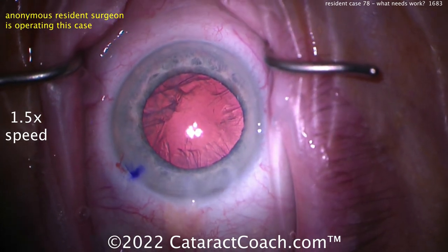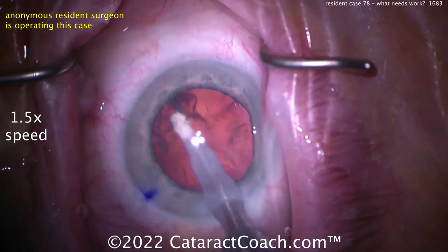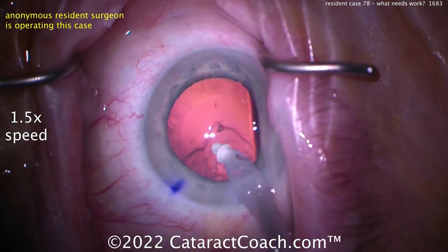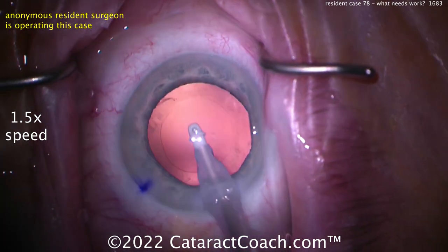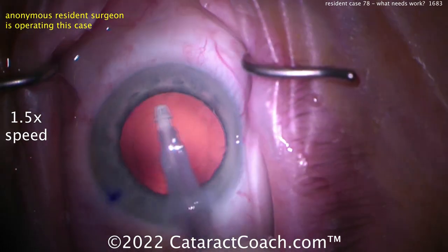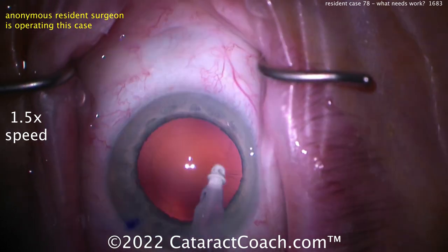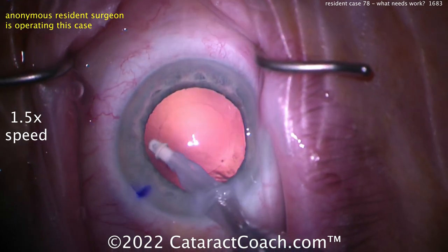Cortex removal — not sure why I did the sweeping there with the BSS injection. You don't really need that during cortex removal. You can actually just get the flow cranked up a little higher and you'll flow a lot of fluid through the eye. In cortex removal it's also to flush things around the eye, and especially in viscoelastic removal, crank up that flow rate to like 50 or 60 cc's a minute to really flush out any viscoelastic.